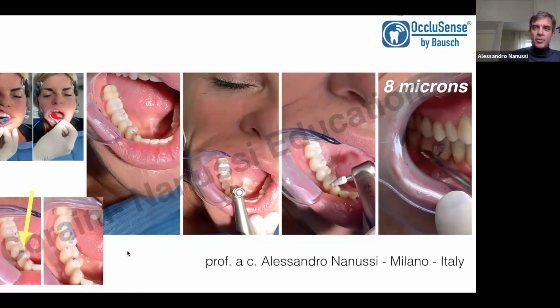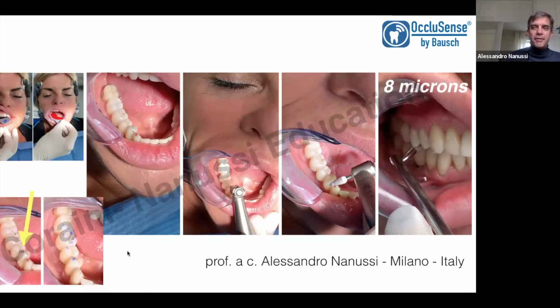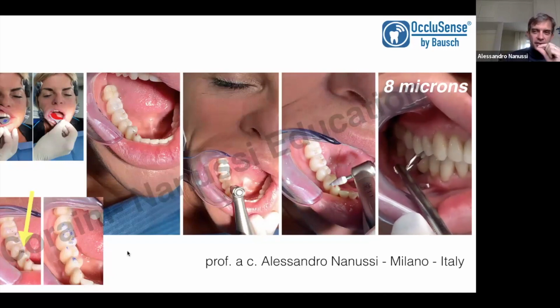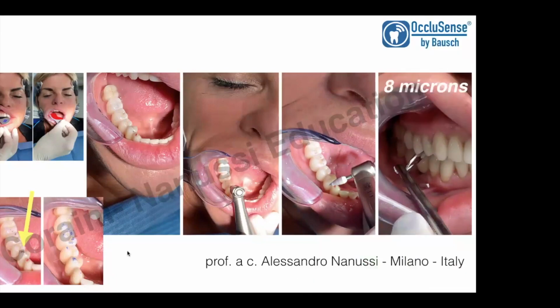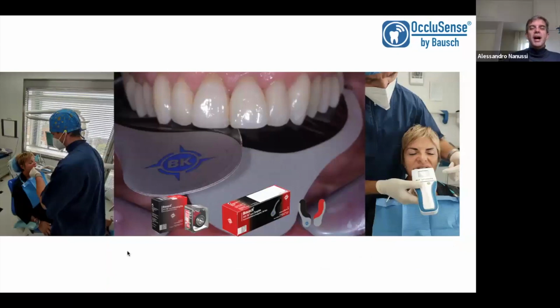And we can check with a shimstock paper of 8 micron thickness to control if the teeth are in perfect contact. But it is not enough. Obviously, after the check of the occlusion with paper, we want to check it also with the OccluSense to check the forces.